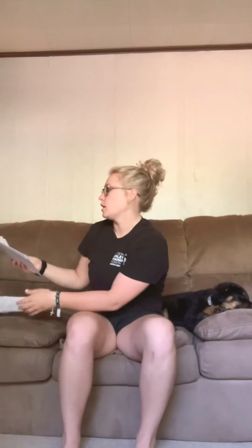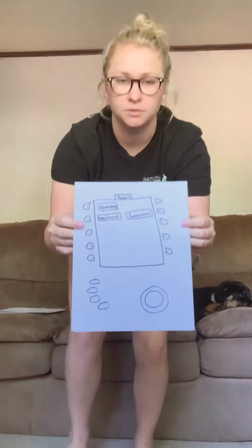Just some physiological preparation. You just want to explain to this patient, if they have never had E-stim done before, how it's going to feel, how it's going to help, how it works. And to go ahead and set up our parameters, our procedures, I have drawn out the machine since I don't have one with me. This is the first screen that we're going to come to.